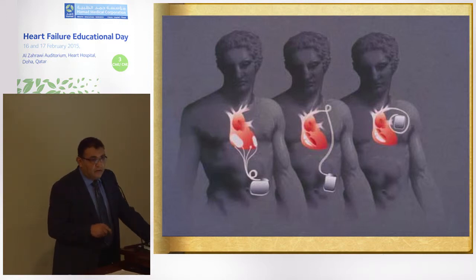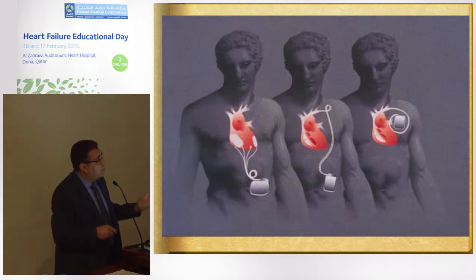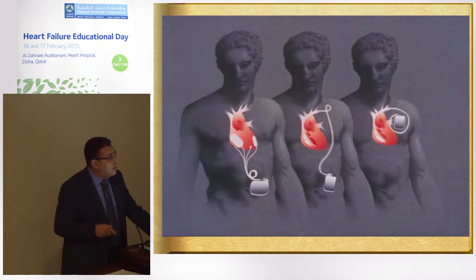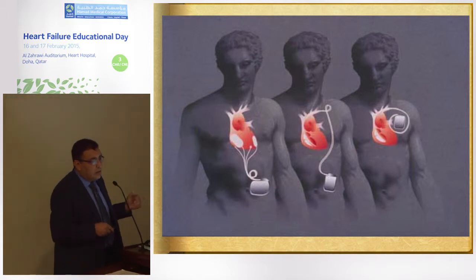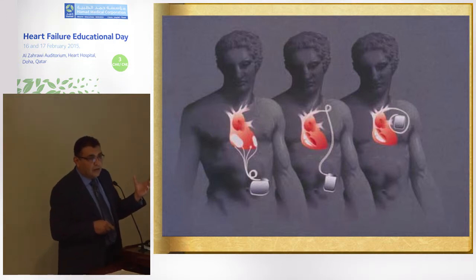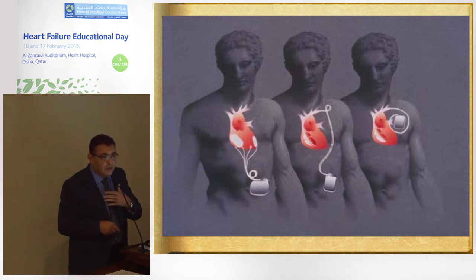Later on, as the technology progressed, they had transvenous leads. This was in the late 80s. However, the devices were still huge at that time, and they required implantation in the abdominal cavity until 1993, when they started to have a smaller device, implanted in the subpectoral or subcutaneous area in the left upper chest.